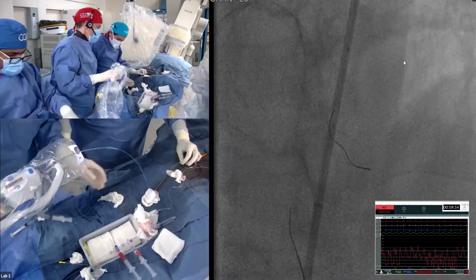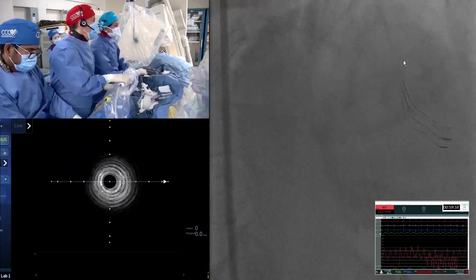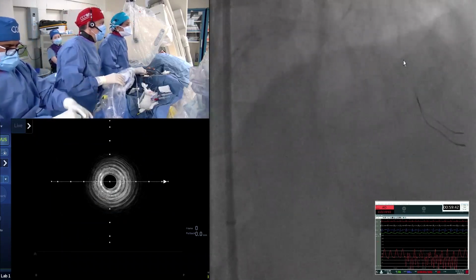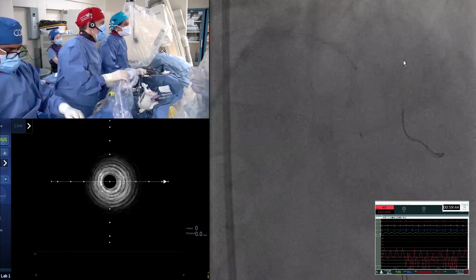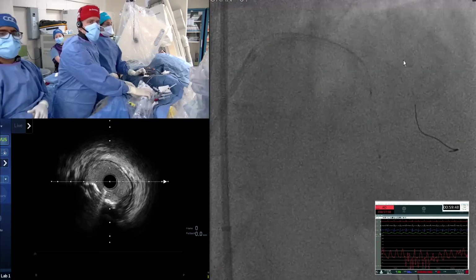But if you look at this view, it looks like when you puffed there, you already put a stent in the LAD. It's so big. So I think you guttered quite a bit. So it would be riskier to pull that wire and then go through a guttering flap. So let's look and see what the IVUS shows.